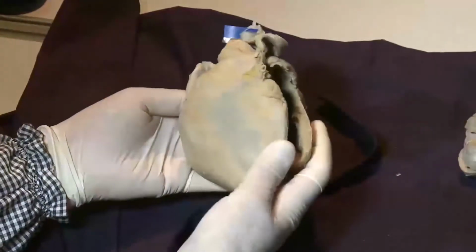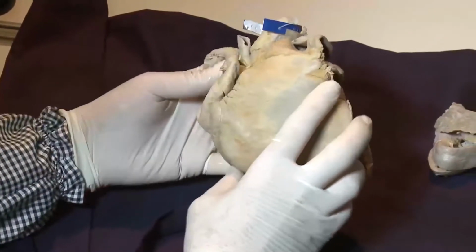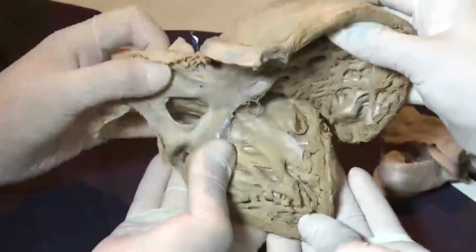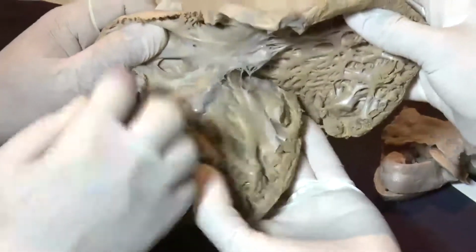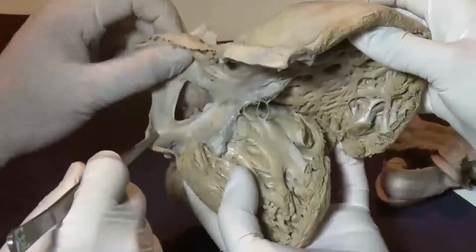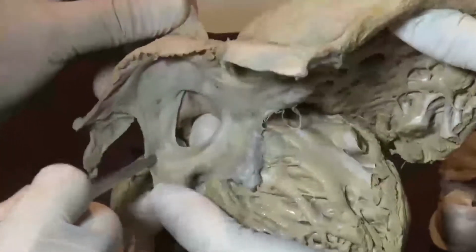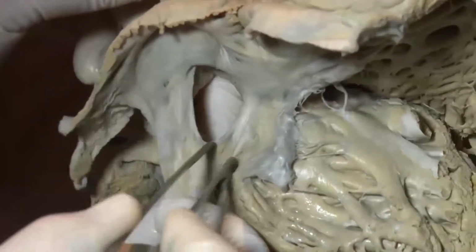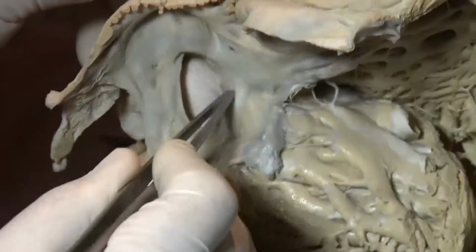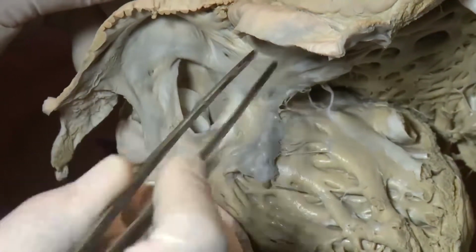This is a case of ASD with Eisenmenger syndrome. As you can see, the RV is enlarged. As I open the heart specimen, you can see there is a big hole in the interatrial septum. This is the SVC. The SVC rim is sufficient, the posterior rim is adequate, and the IVC rim is adequate, so it's good for device closure. However, as you can see, the anterior rim is absent in some areas.